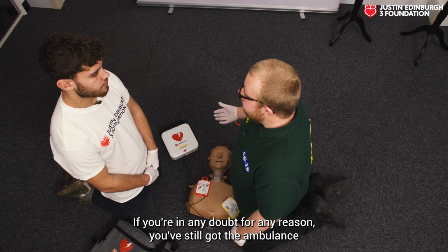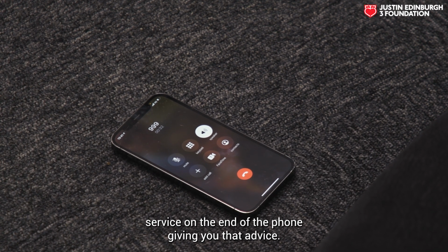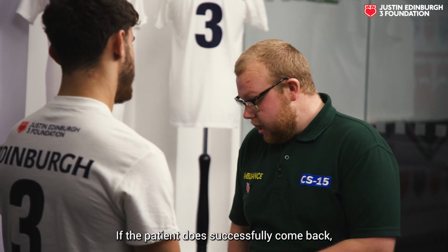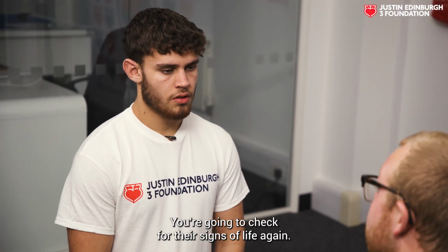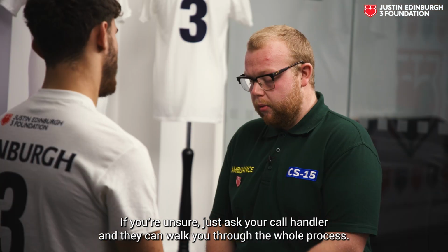If you're in any doubt for any reason, you've still got the ambulance service on the end of the phone giving you that advice. If the patient does successfully come back, the machine will say no shock advised, and check for signs of life. You're going to check for those signs of life. Again, if you're unsure, just ask your call handler and they can walk you through the whole process.